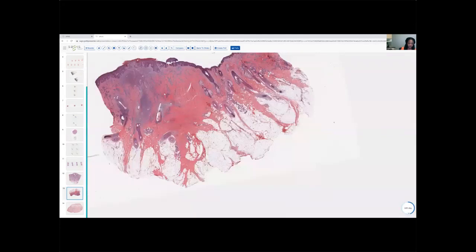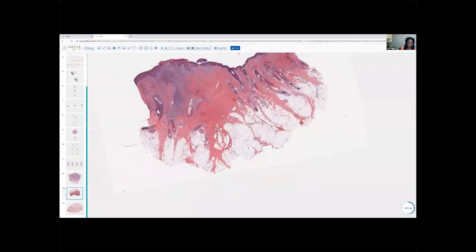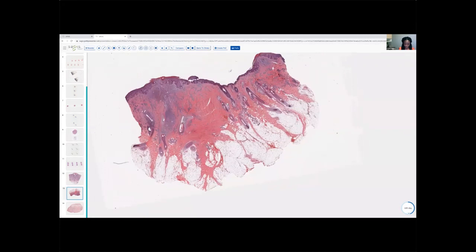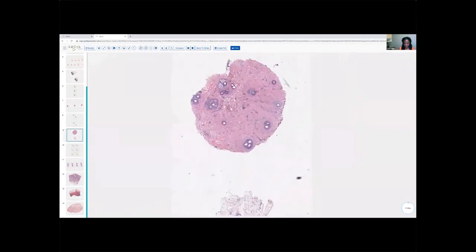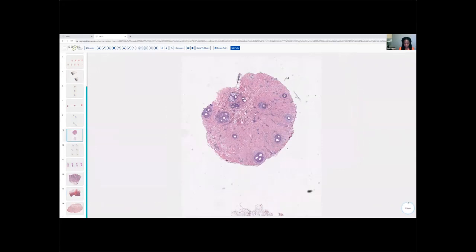And another feature that these two diagnoses share with each other, in addition to being very inflammatory in one phase but leading ultimately to scarring as a result of that suppurative dense inflammation, is polytrichia. And again, polytrichia is just another sequela of scarring. It's just another consequence of these scarring processes. So let's look at a less inflamed diagnosis where we're also seeing polytrichia.